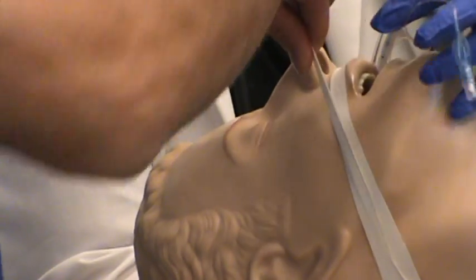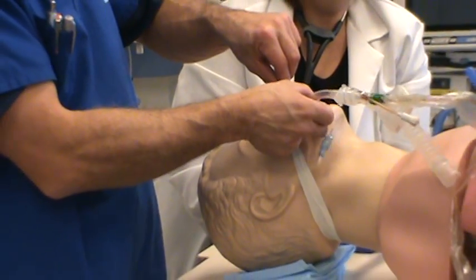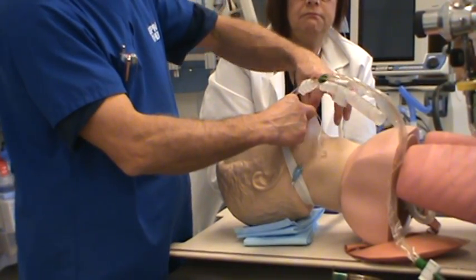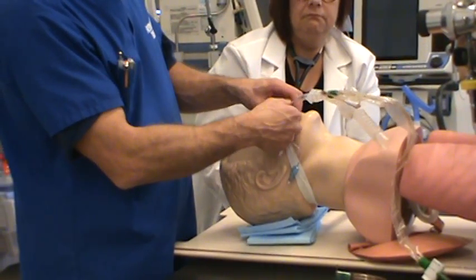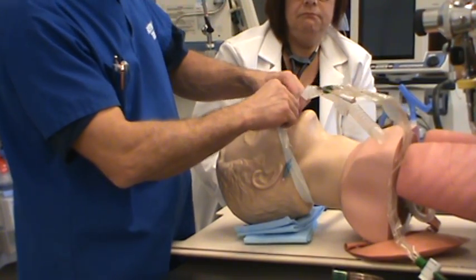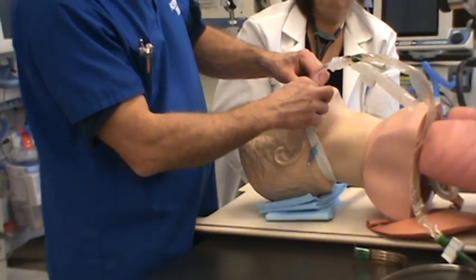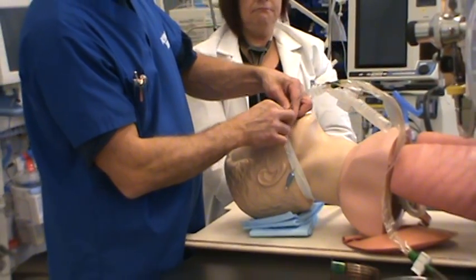Next, bring the top tape up and grab the tube from Diane. Let the person you're working with know when you've got the tube or when they should be looking after it. Bring the tape up, go over top of the tube while still holding on to it, and secure the tape around the tube. Take care to make sure that the pilot balloon line doesn't get taped between the endotracheal tube and the tape itself.